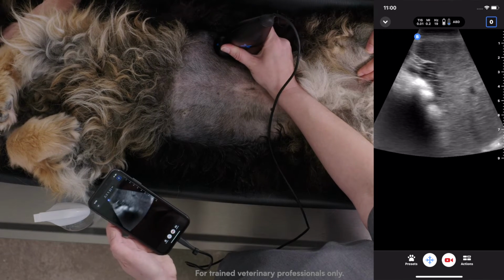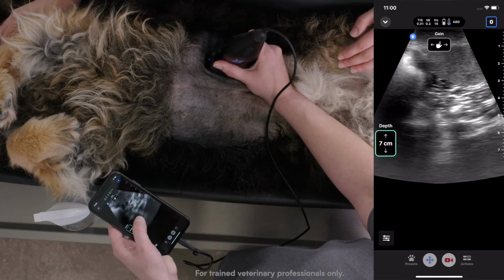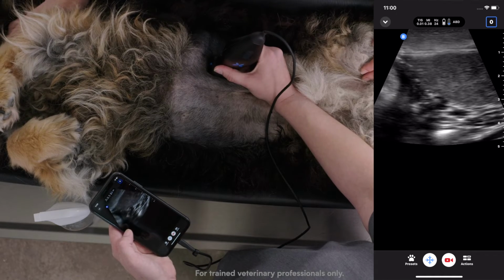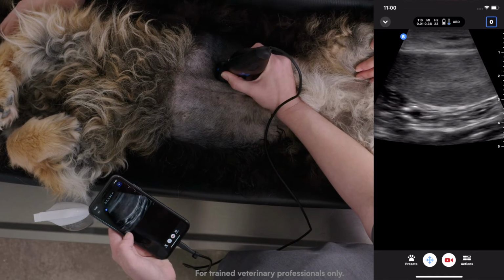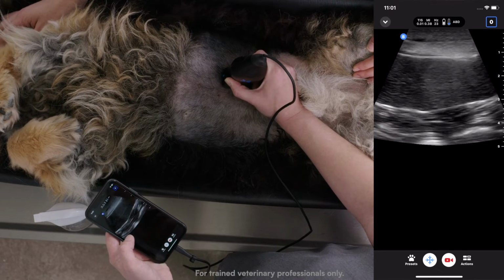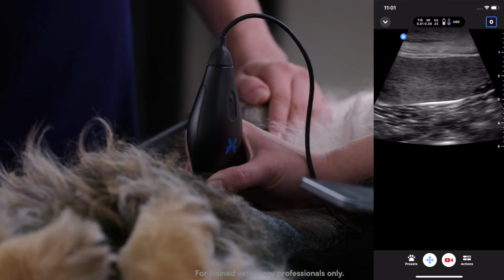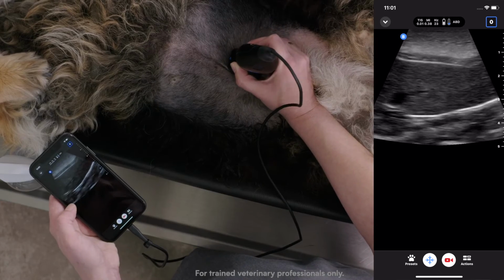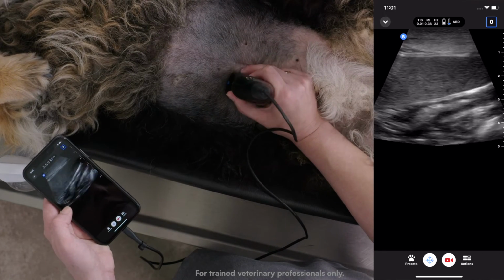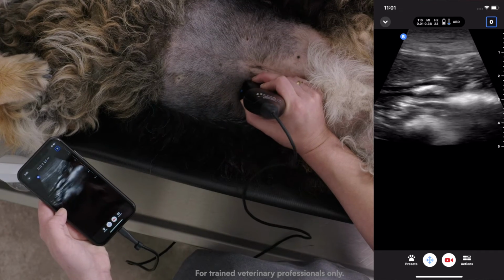Once you're done there, you'll head back into the sagittal plane, going back a little bit to that xiphoid area where we first found spleen. You'll then decrease your depth, and as you move caudal to the abdomen, fan through left to right to find which way the spleen is moving. If it gets narrow in your spectrum, then you know it's not moving in that direction. If it starts to get wider in your spectrum, that's truly the course it is traveling. And then you'll keep going all the way caudal until you identify the splenic tail.